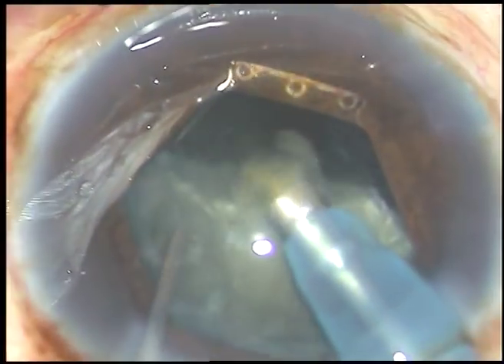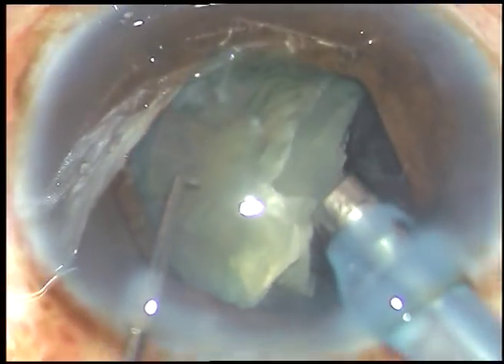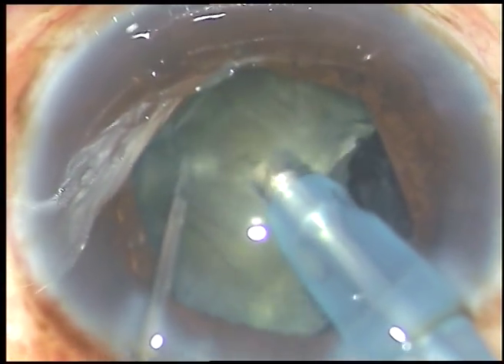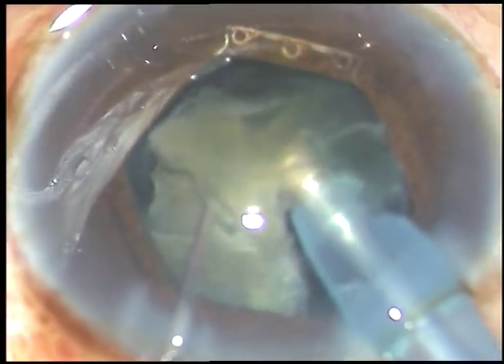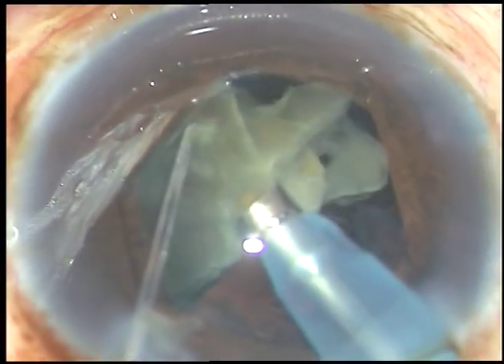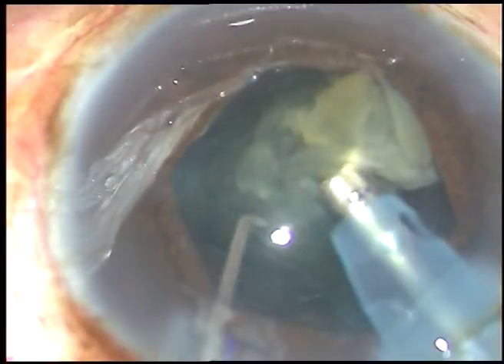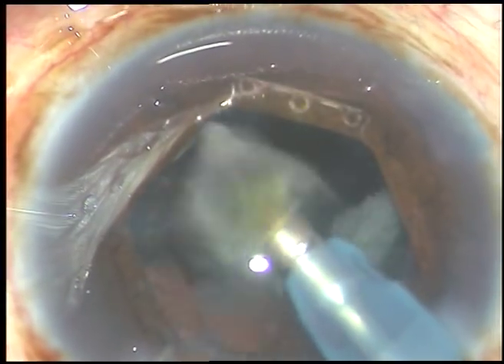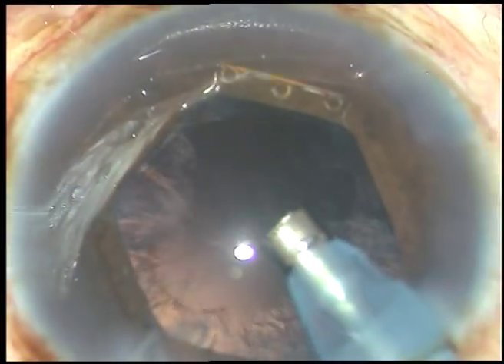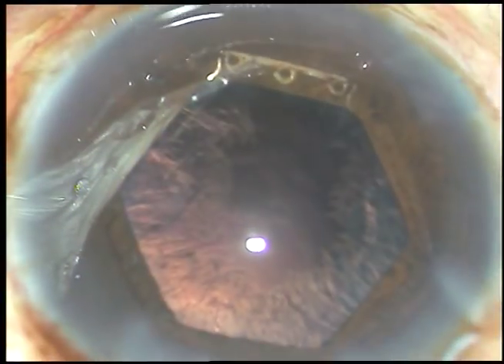One hemi-nucleus has been emulsified and removed. This is the other hemi-nucleus — it is also held with high vacuum and chopped into two parts. Each part is emulsified and removed. Iris is at its normal position and the anterior chamber is deep, not like when using iris hooks where the anterior chamber becomes shallow.